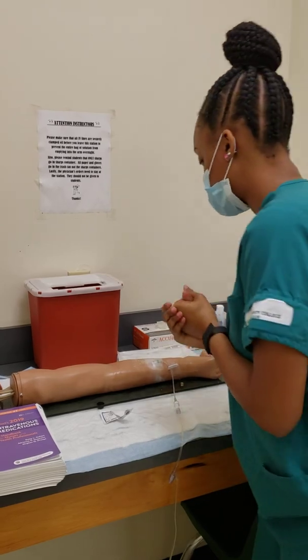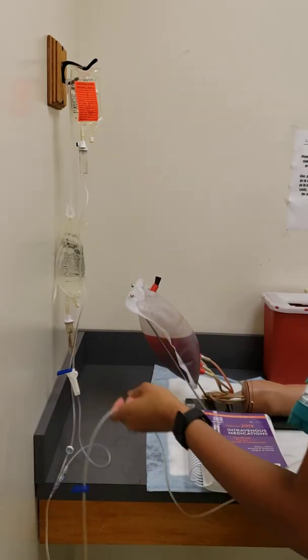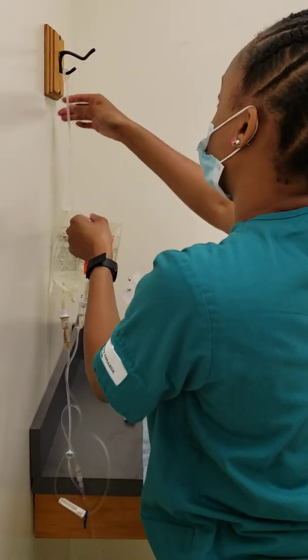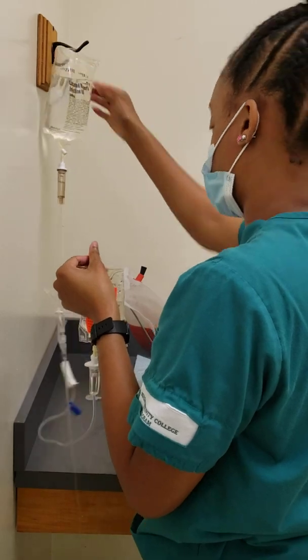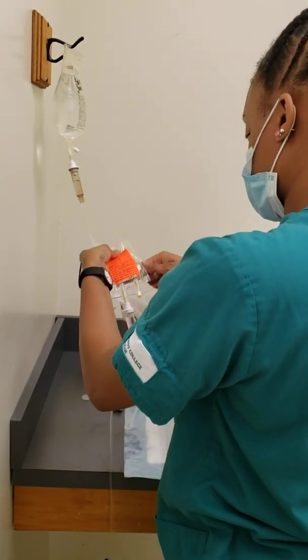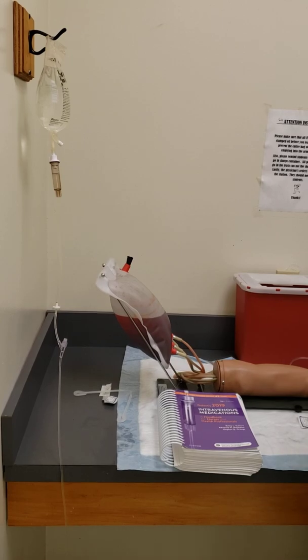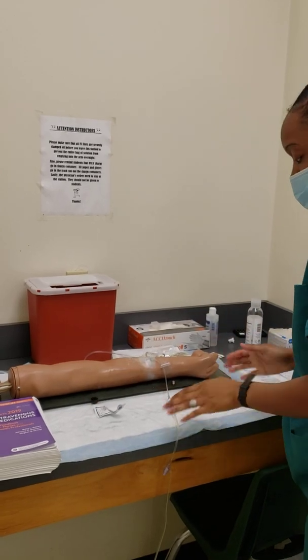All right. So what I'm going to do, Miss Davis, I'm going to go ahead and stop your fluids. Okay. So we're going to go ahead and stop the fluids. Okay. And what we're going to do is we're going to lower the secondary and discard that, and we're going to hang the primary back up and make sure it's going to stop. Okay, and we're going to discard of this in the appropriate bag, and we're going to go ahead and hang the primary back and regulate the fluids.